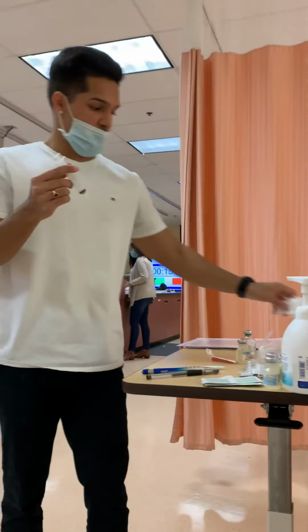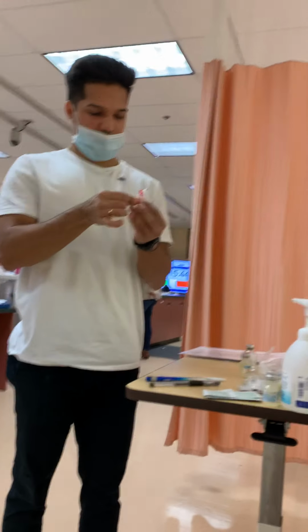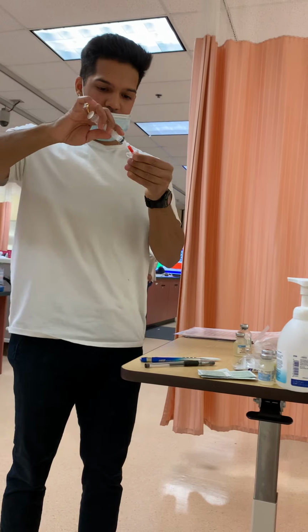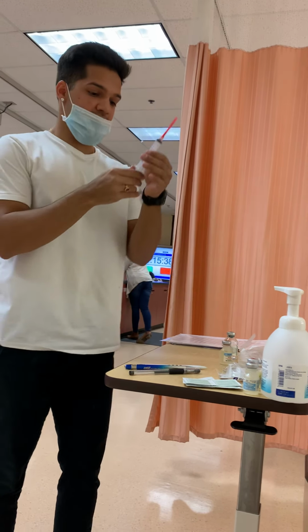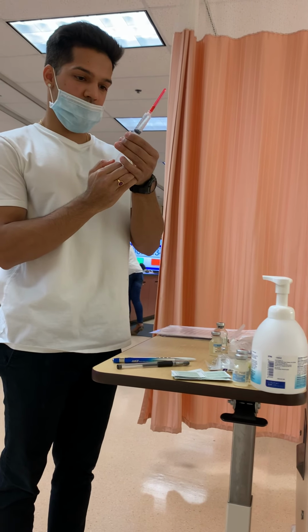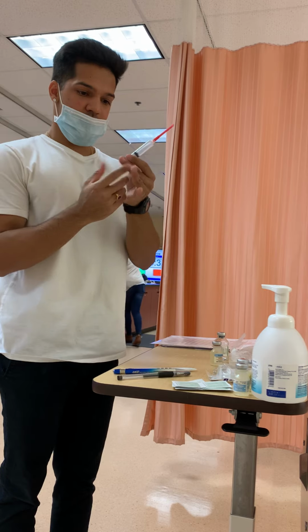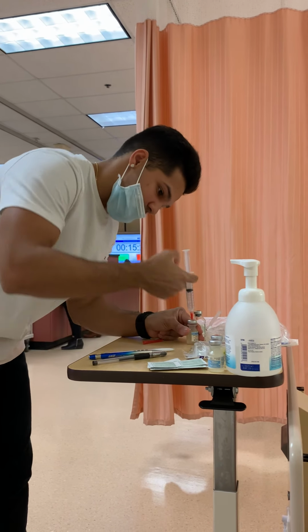I'll bring back my syringe and attach my blunt fill. Once I've done that, I need 6.8 mLs of sterile water. Therefore, I'll be injecting 6.8 mLs of air into my sterile water, and I know the top is clean because I just wiped it.